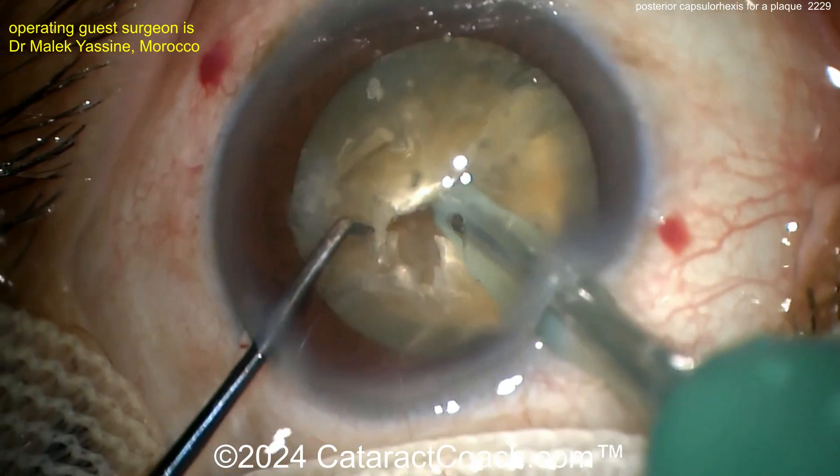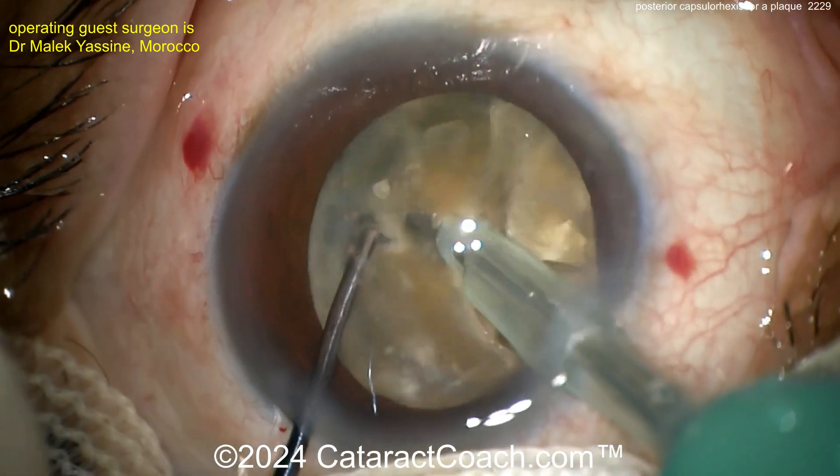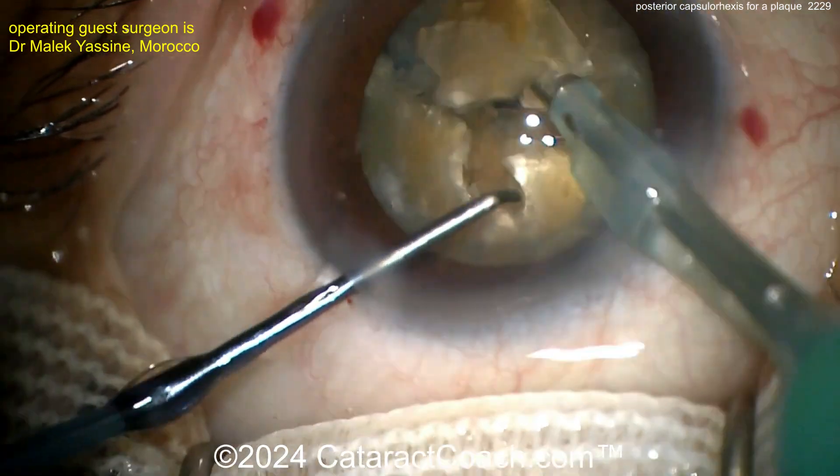Getting that nucleus rotated again, buzz on the FACO probe, and then the chopper goes around the equator — a nice chop. Beautifully done. With four quadrants, start removing the pieces. There you go, that's a good idea.